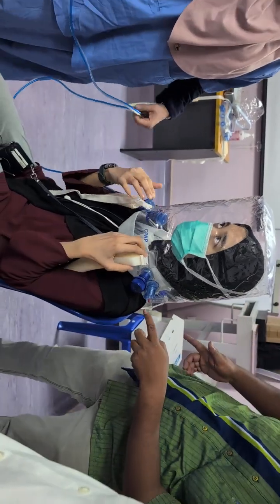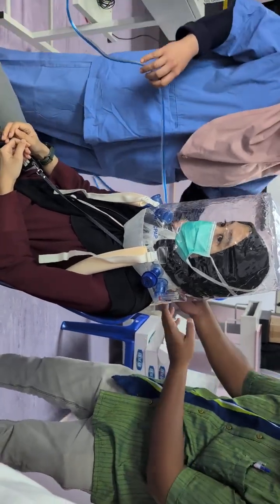So where is it leaking? The peak is there but it doesn't rise. So sorry doctor, you see?